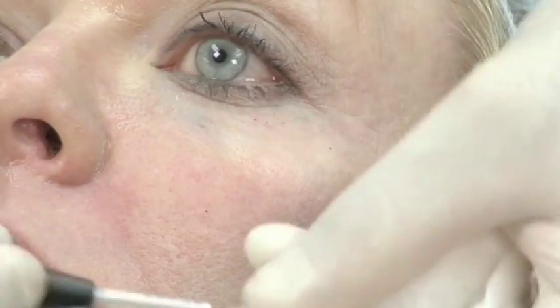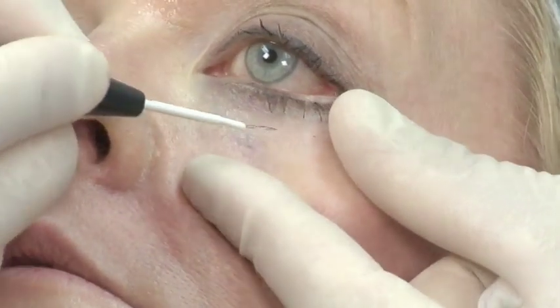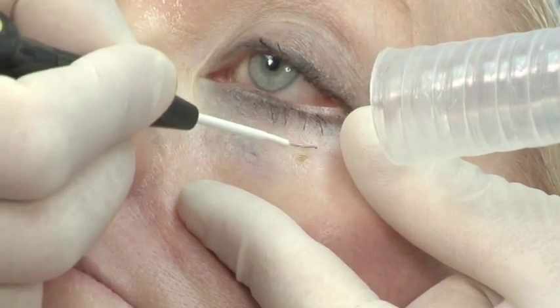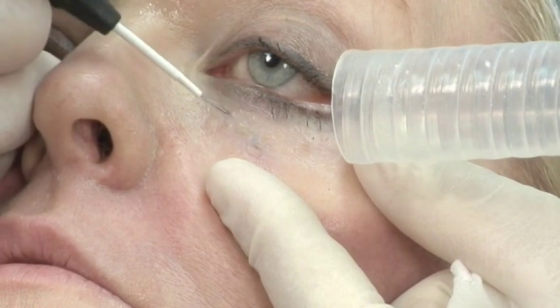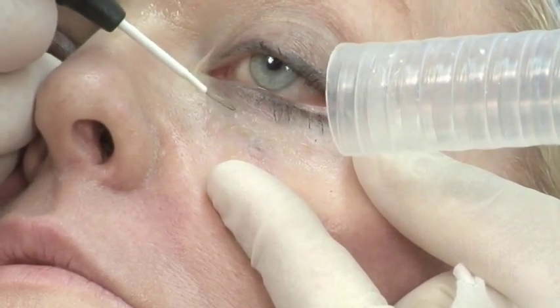We can't necessarily keep them from making new ones or forming new ones. But I think that the recovery and the effectiveness using this Elman radiofrequency device is, in my hands, the most effective thing for treating these. I want to keep my loop free of debris. Be careful not to go too deep.